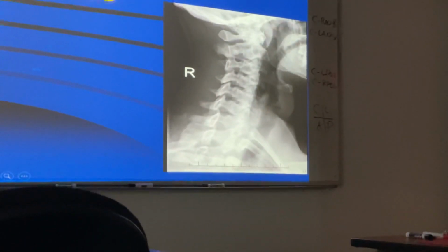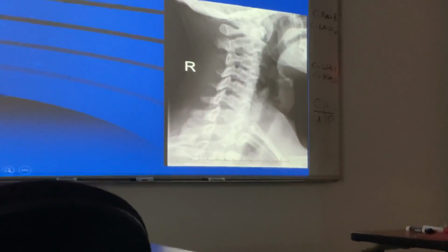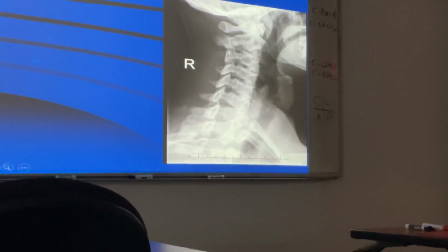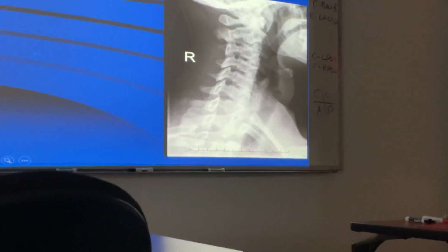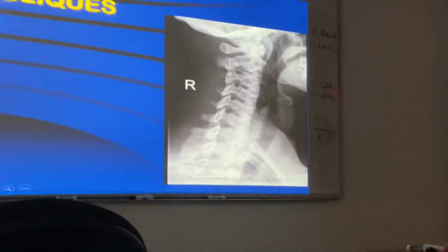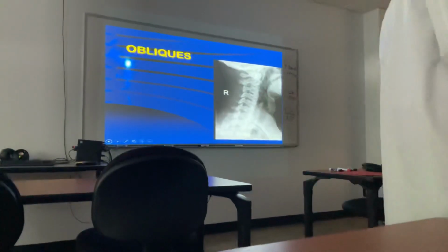But at the office, we're going to follow that convention, but there are offices out there that don't follow the convention. Now, if you get the x-rays from another office, don't try to guess at how they did it. You're going to have to physically call them and ask, was the patient's front to the capturing device or the film, or was their back to it? That avoids all that misinformation and possible wrong diagnosis, if you will. But I know for sure if I do a right anterior oblique view, I will see which IVF? Right side. Okay, that's all you need to know.